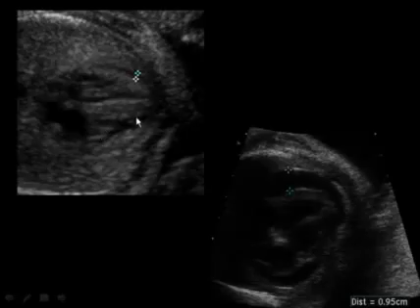So what do I mean by that? Well, here's the possible pericardial effusion seen here. But this is actually just the edge of the myocardium. You can see some echogenic inner edge and then the hypoechoic myocardium here. When in doubt, try to identify whether this possible fluid goes past the level of the valves. If it crosses the level of the valves, it's much more likely to be fluid, as seen in this patient, where you see the myocardium here and the pericardial fluid going all the way around the level of the mitral valve.